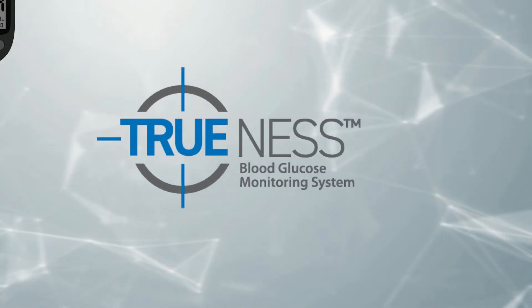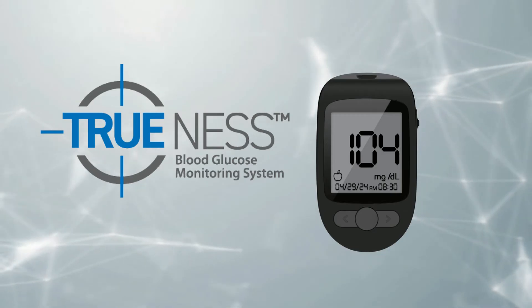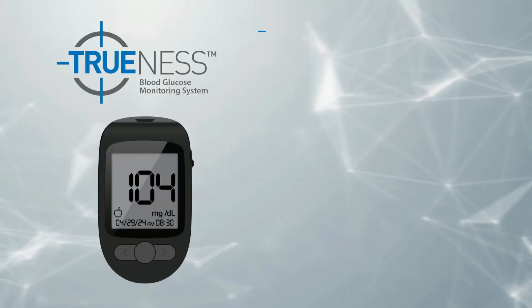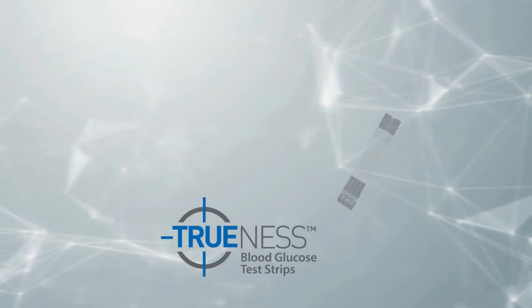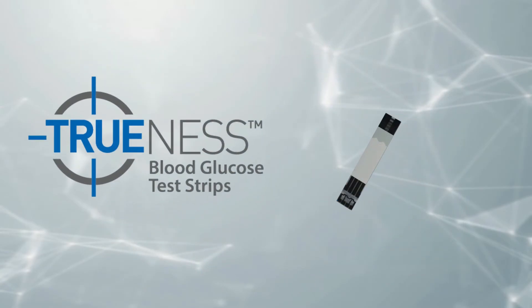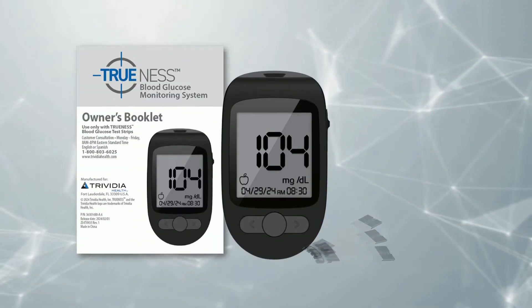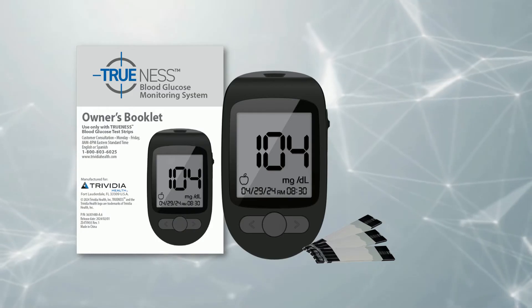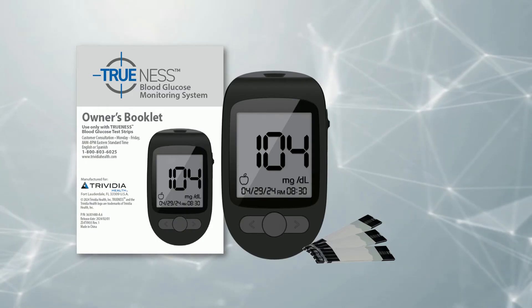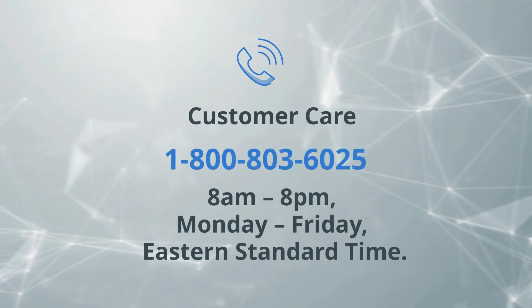Introducing the Trueness Blood Glucose Monitoring System. Both the Trueness Blood Glucose Meter and Trueness Air Blood Glucose Meter use Trueness Blood Glucose Test Strips. The following presentation is designed to help you test with confidence using the Trueness Blood Glucose Monitoring System and demonstrate how to perform a blood glucose test. Please refer to the Owner's Booklet for detailed instructions and additional features of the system.